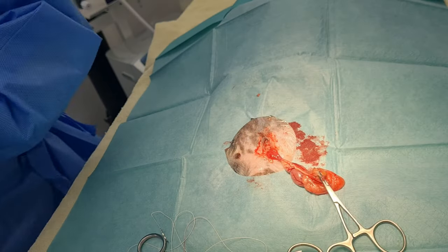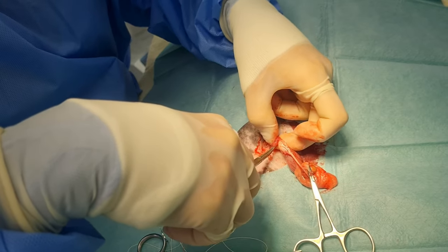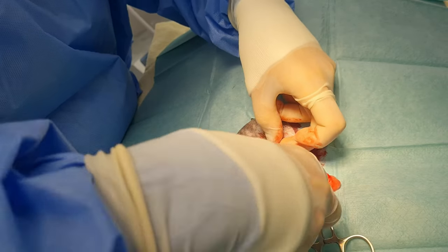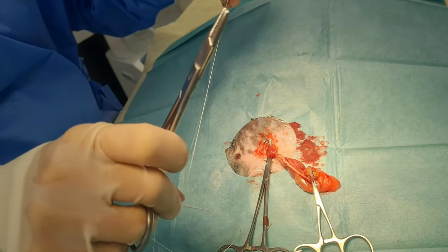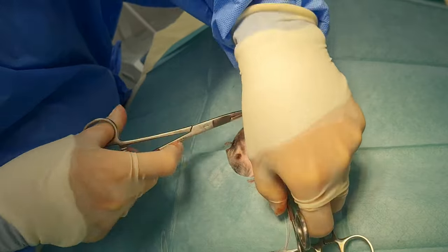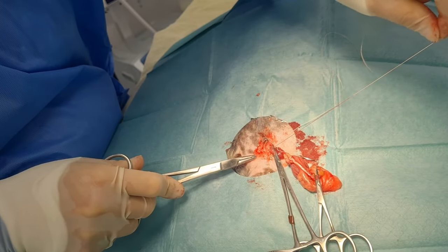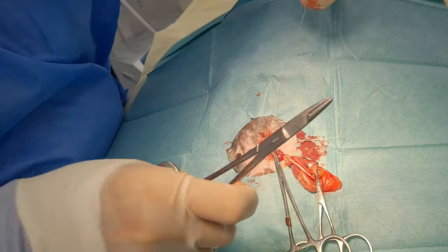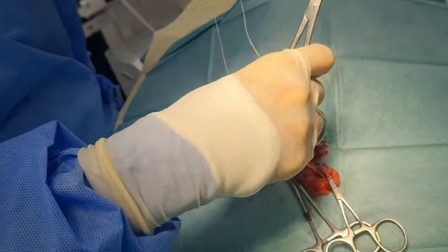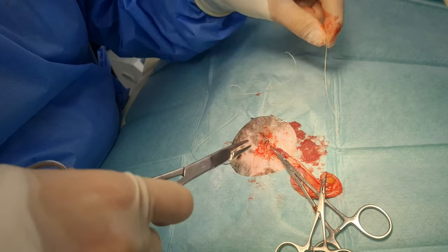Now we're back to the tunic. What I like to do — to minimise the chances of herniation of abdominal contents through into the scrotum — is to invert that tunic, which happens naturally as you're doing it, and then do a transfixing ligature through it. So we are ablating the tunic, which is quite muscular on a guinea pig, and inverting it at the same time. It just means we've got a closed inguinal canal, less likely to herniate. I've been using this technique for about seven years and have only had two that herniated, so it's pretty low risk.